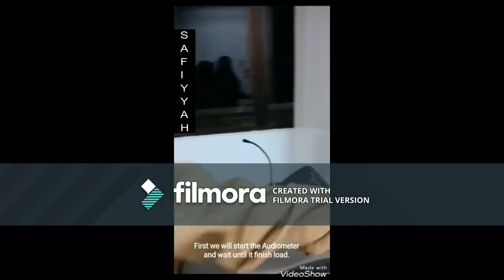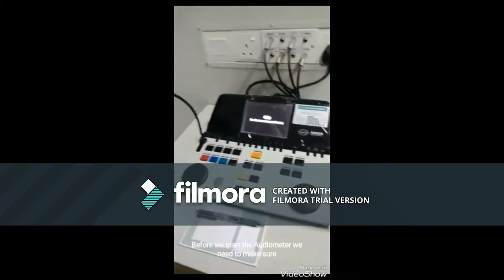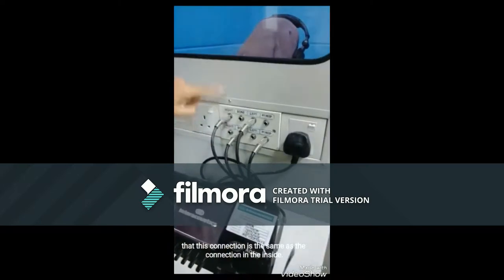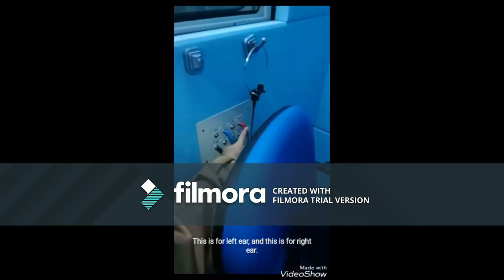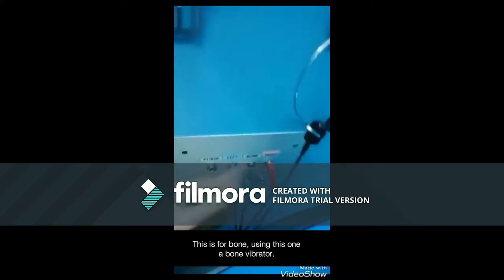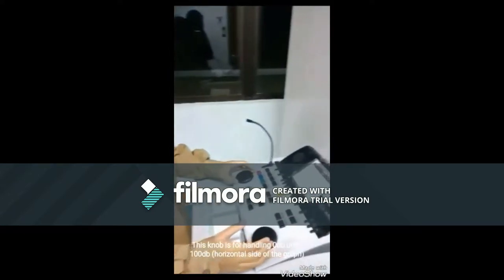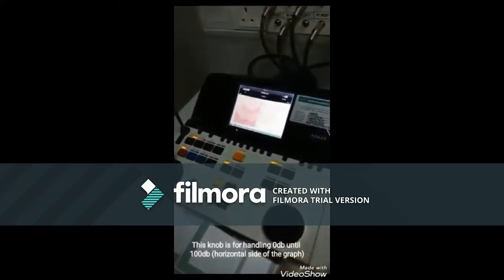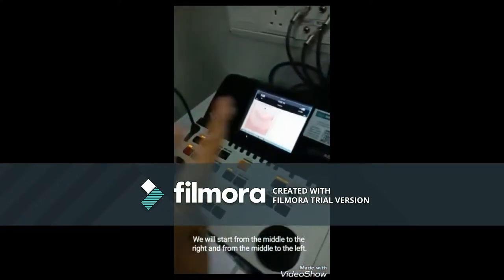First, we will start the audiometer. Okay, we will wait until the audiometer loads. Before we start the audiometer, we need to make sure that this connection is the same as the connection on the inside. This is for left here, this is for right here. This is for bone, using this one, the bone audiometer. Okay. This knob is for handling the 0 dB until 100 dB.